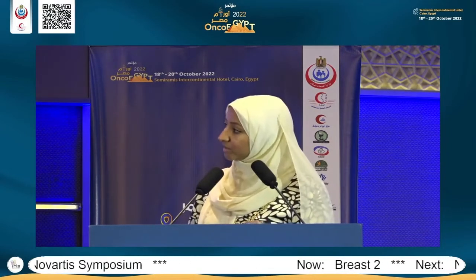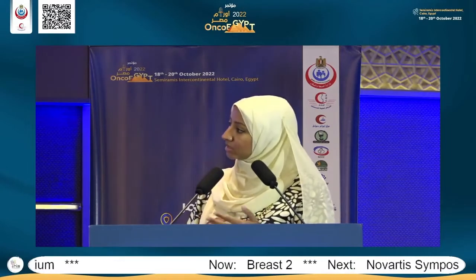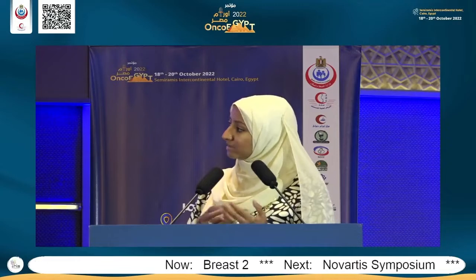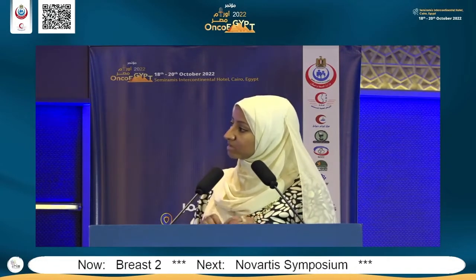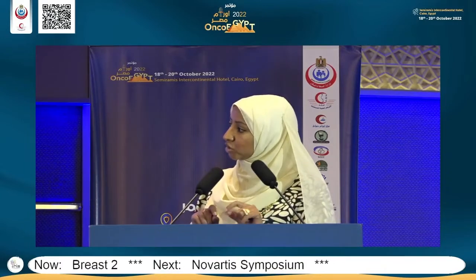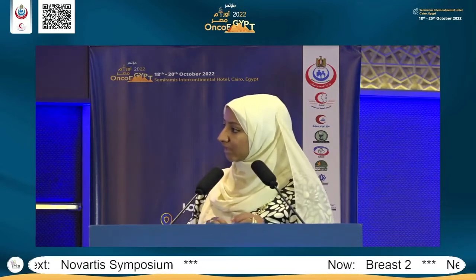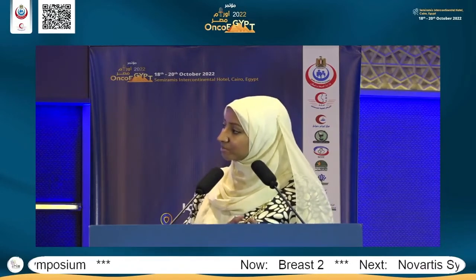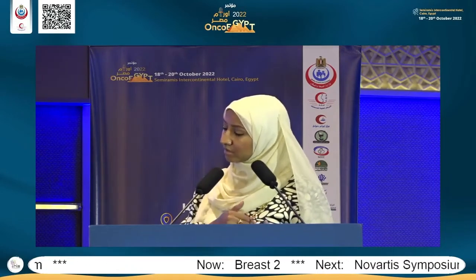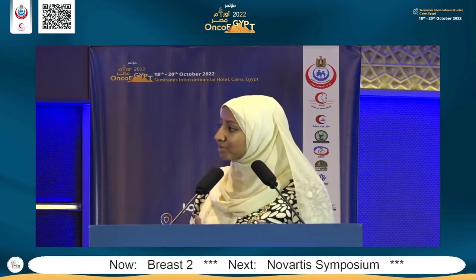فالكونتراست انهانس ماموجرافي بيخدمنا جدا في النقطه دي، ان لما بتيجي تعمل كونتراست الجزء اللي موجود ده اللي مش واضح عندي في السونار ولا حتى في الماموجرافي بيبقى واخد انهانسمنت، فعلى الاقل اقدر احدد اشوف الليجن نفسه من فين لفين، او الجزء اللي موجود دلوقتي بعد الكيموثيرابي ده اللي هيتشال بعدين اقدر اعرف هو من فين لفين، حتى عشان اقدر اركب واير بعدين يبقى جايدد للسيرجري. فدي بتفرق معانا بعد كده في حالات البيشنت اللي بيبقوا ميزد كليبنج وبيبقوا واخدين كيموثيرابي في كومبليت ريسبونس على الليجن.